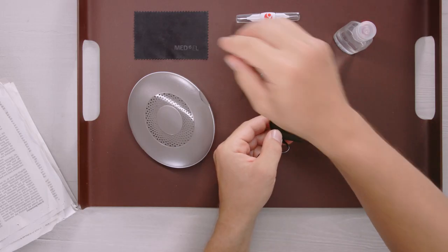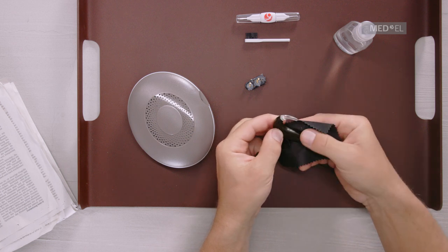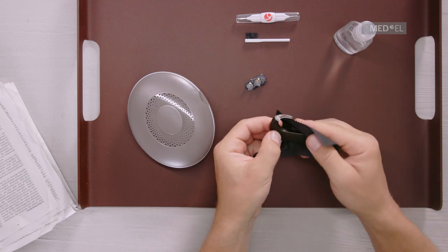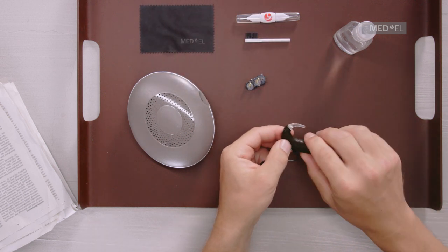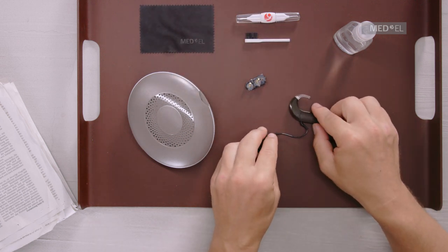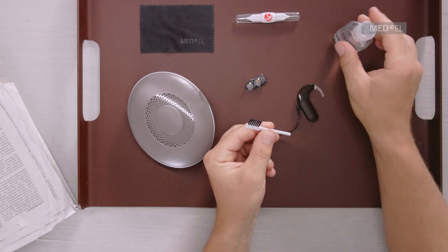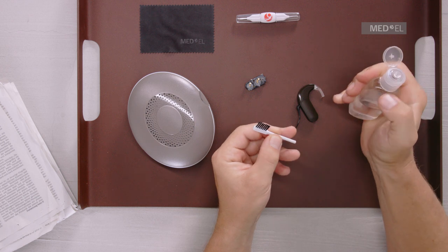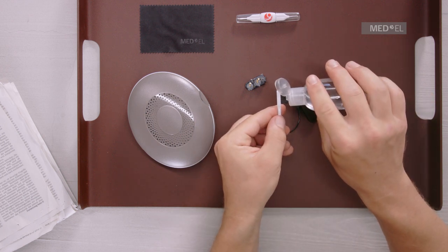You should clean Sonnet 2 regularly by wiping it with a soft, damp cloth. Don't use cleaning solutions, and take extra care when cleaning small parts, such as the battery contacts and microphone covers. Inspect the battery contacts regularly. To clean them, you can use the provided brush and a small amount of rubbing alcohol, and then gently wipe them dry.